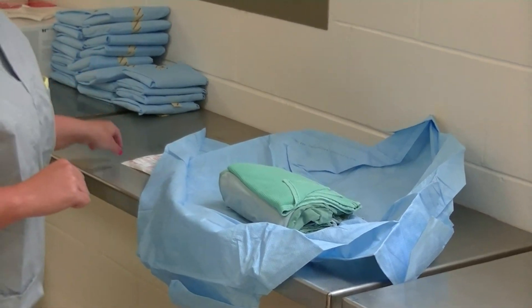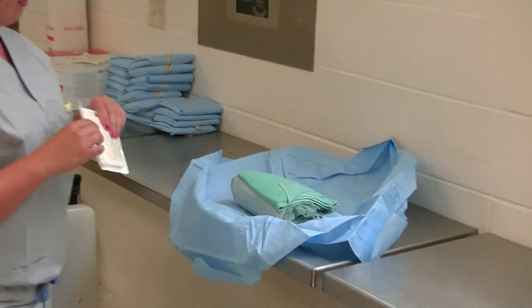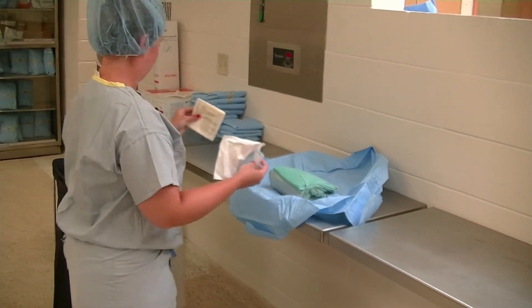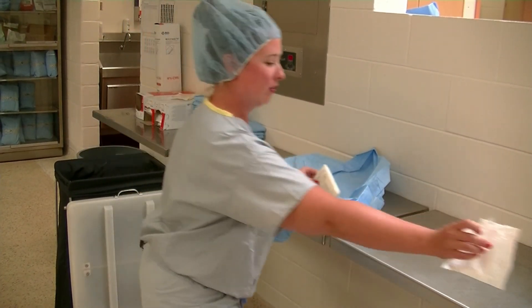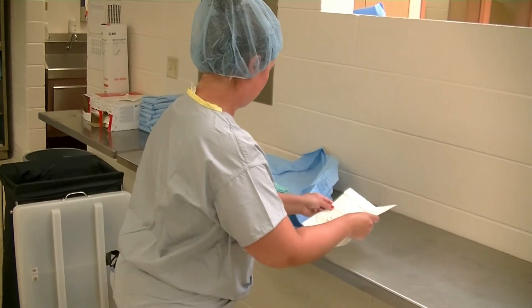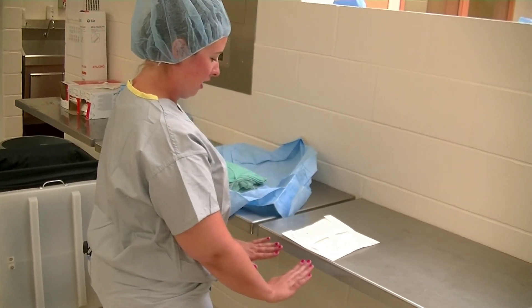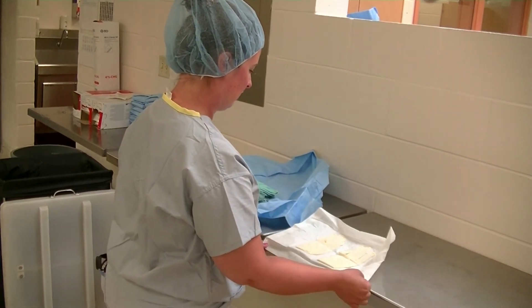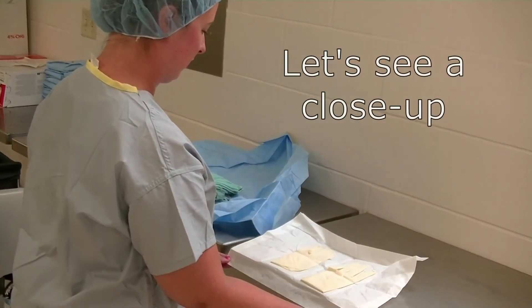Next we're going to open up our gloves. Open up your package of gloves — the wrapper will go into the garbage can. Place your gloves next to your gown, on the edge of the table, so that you have a sterile surface against the edge of the table when you come to put your gloves on.